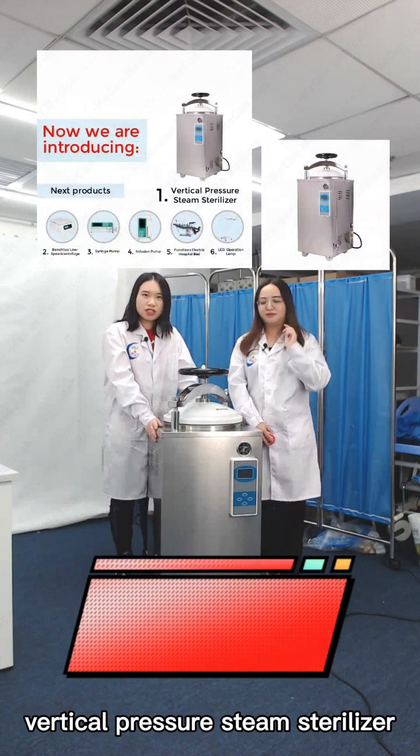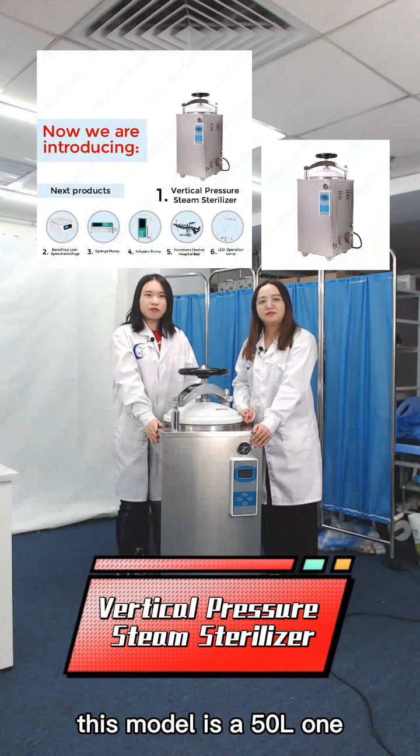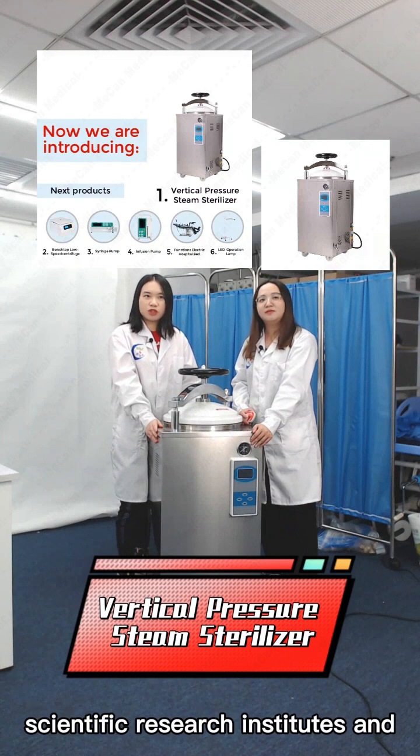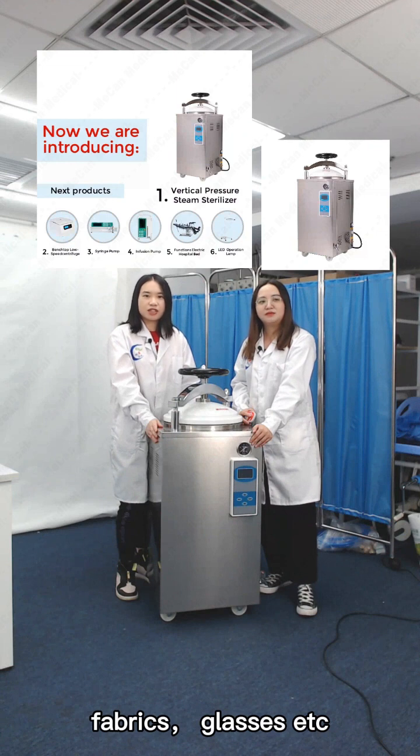We will introduce this Vertical Pressure Steam Sterilizer. This model is a 50-liter one. It is suitable for clinics, scientific research institutes, and other organizations to sterilize surgical instruments, fabrics, glasses, etc.